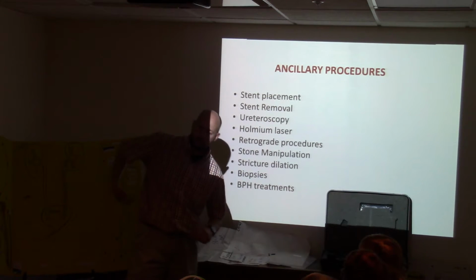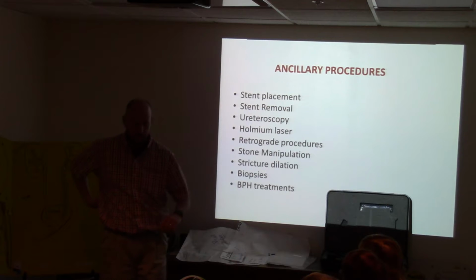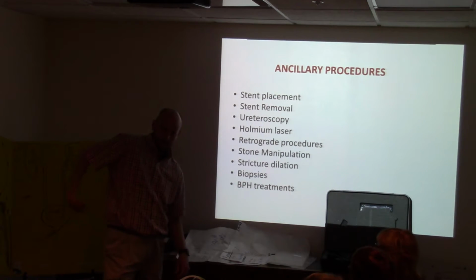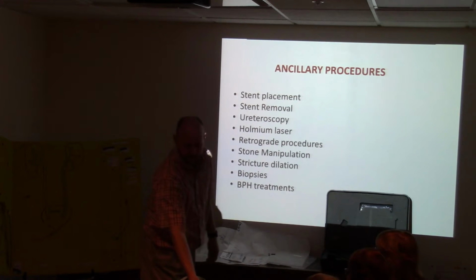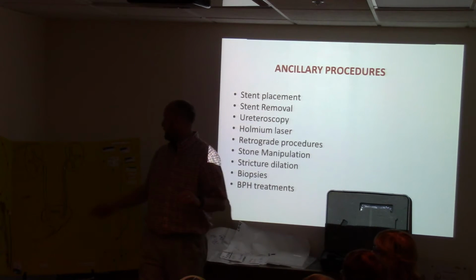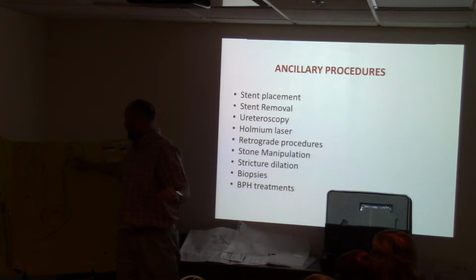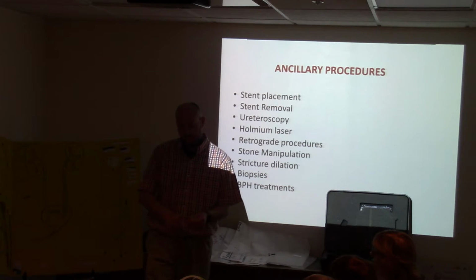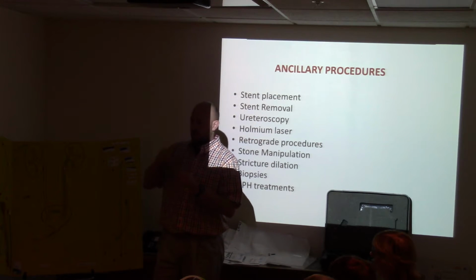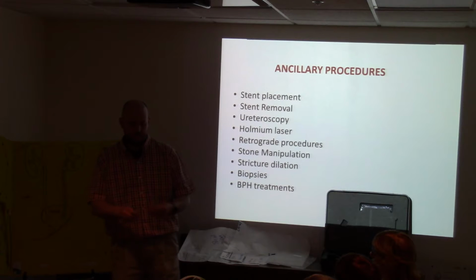So they actually have to go in through your back, a percutaneous. First, they'll stick a needle in your back, and then through that needle, they'll stick a wire, just the same type of wire, to get access to your renal pelvis. And then through that, they'll stick another catheter in, and then they'll go through that, and they'll break up the stones either with a laser, EHL, different ways.